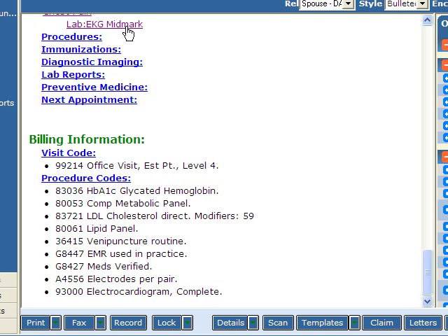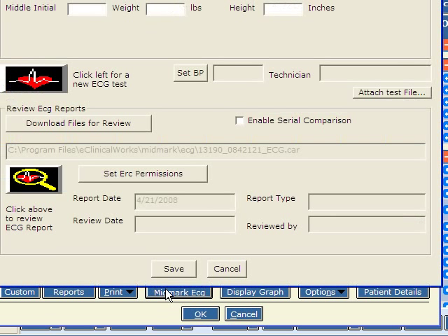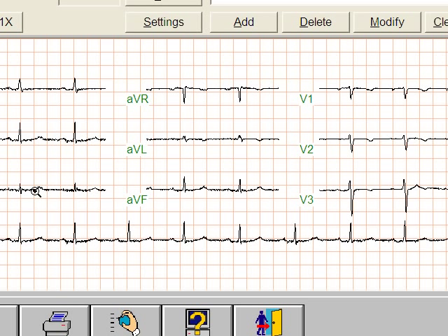Now let's go back and see what it looks like. We can go back to the chart as long as it's not locked. Go back to the Midmark order. Click on the Midmark button. Instead of starting a new EKG, we're going to look at the old one. And there it is.